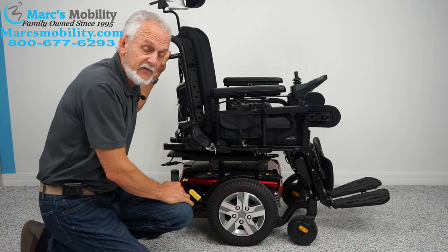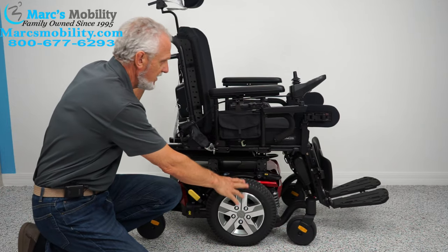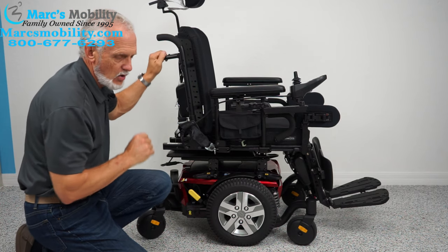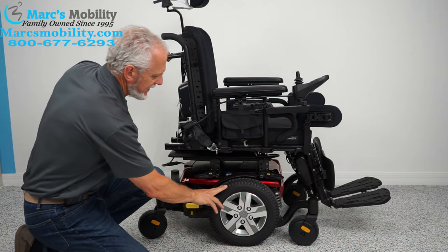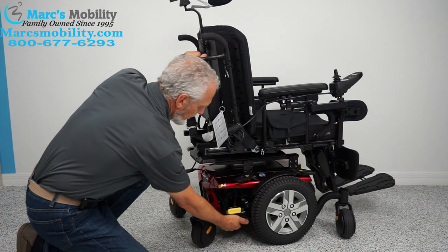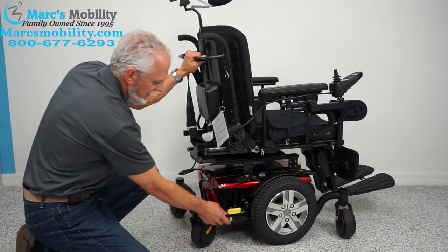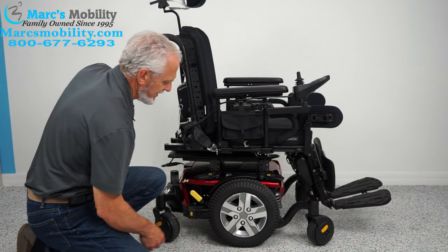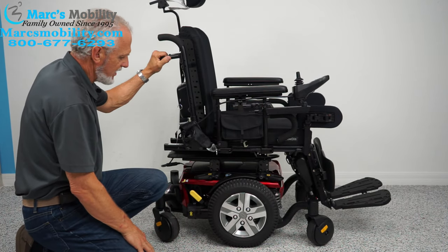This chair weighs about 350 pounds, so I'm not going to be able to lift or push it while it's in gear. If you turn the power off, you have no resistance in the motor. Then go to the yellow lever and push it down. You have a motor on each side and you need to turn the lever down on both motors. When you're done, make sure you put it back in gear — you can hear it click in. Then turn your power back on and you're ready to go.